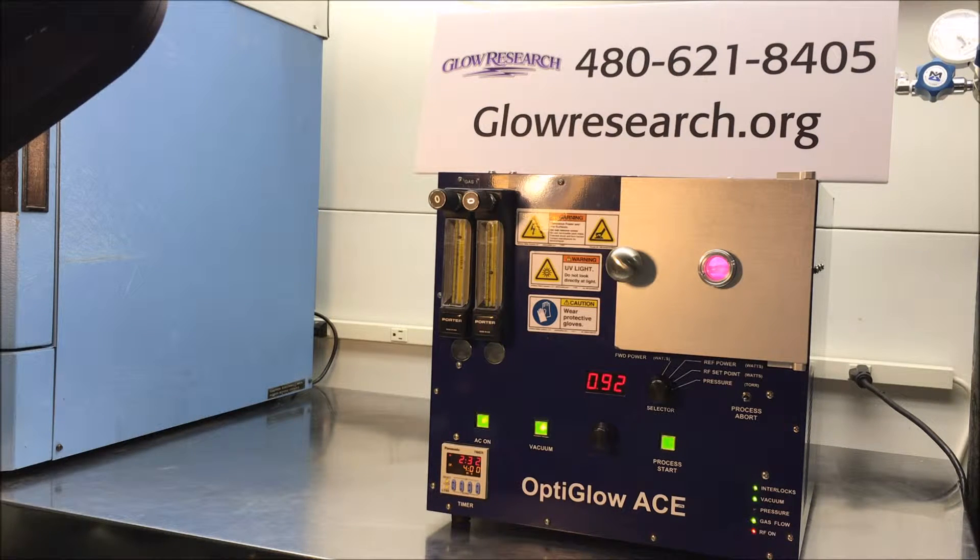The OptiGlow ACE system has automatic tuning at 13.56 megahertz, has a Pirani gauge for the vacuum, and can strike a plasma as low as 10 watts or as high as 150 watts. You can adjust the power in one watt increments. The system is found to be extremely flexible and extremely reliable.